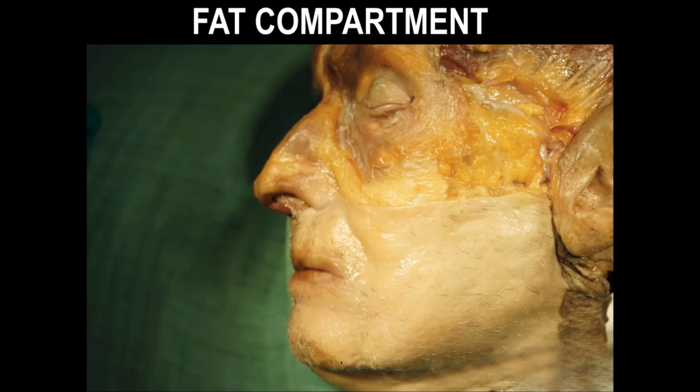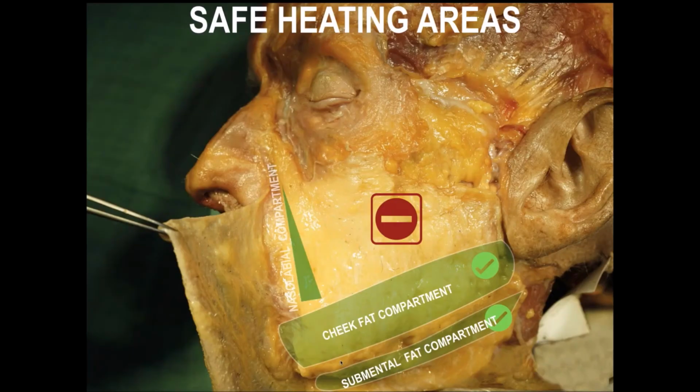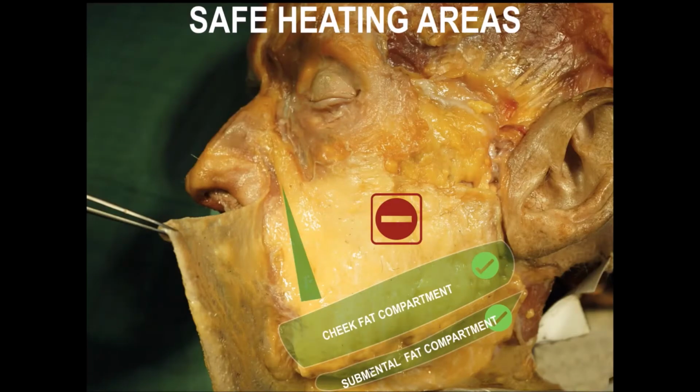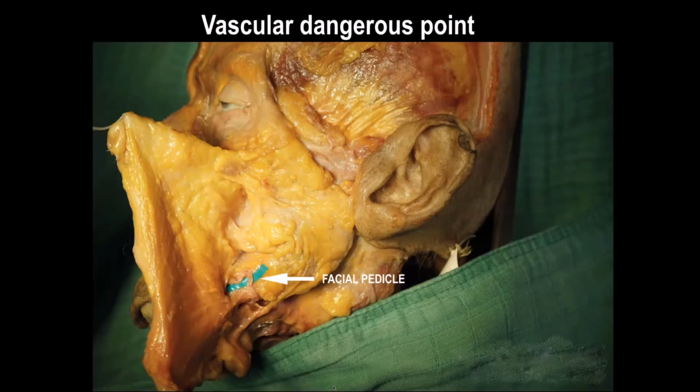So fat compartment, cheek fat, submental fat, and nasolabial. Sorry, I go back. Okay. Cheek fat, submental fat, and nasolabial compartment. This is what we can do in the lower mid face, and where we must be safe, even if we can avoid some dangerous point, like the facial artery. We will see after in a video the facial pedicle, and you can see that this is now very deep. It's going through the muscles, through the platysma, and is below the fat we are treating.